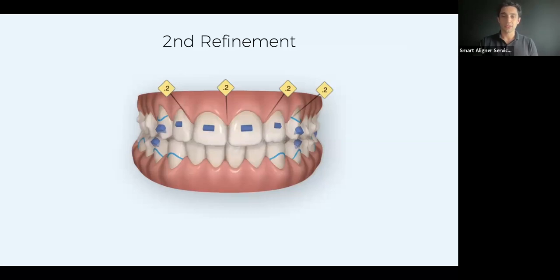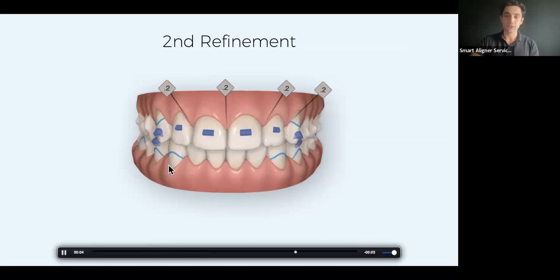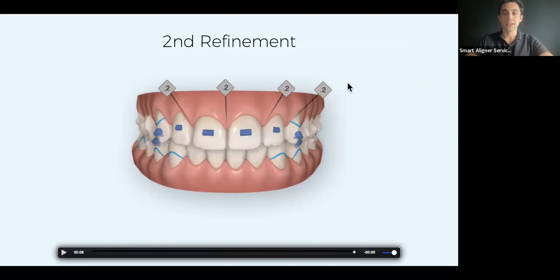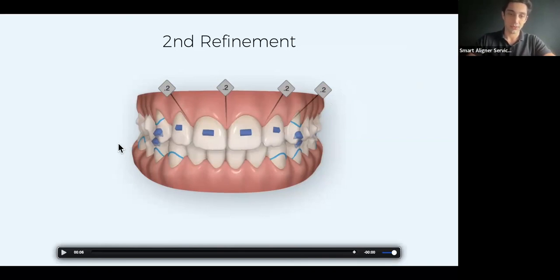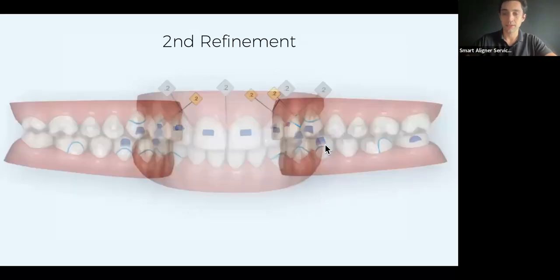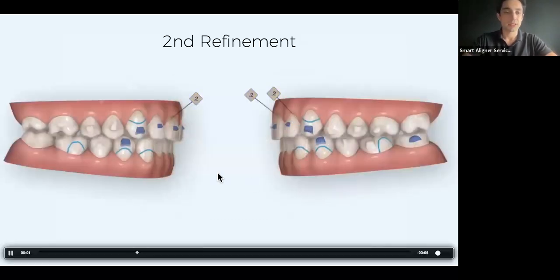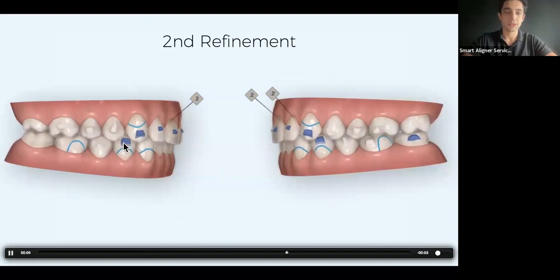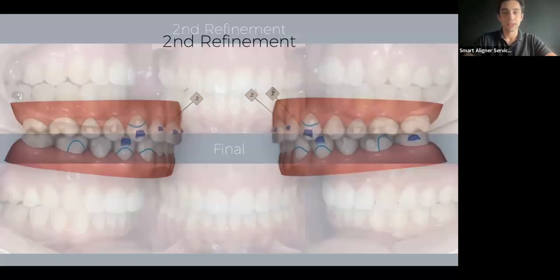Upper and lower midlines are not completely centered, so during the extrusion of upper teeth we place nighttime elastics from tooth 23 to 43 to ensure both midlines are centered. The midline discrepancy is solved with nighttime midline elastics combined with Class 2 elastics on the right side. On the left side we also placed a Class 2 button but didn't need to use it, as Class 1 was well maintained. After about 11 aligners of this phase, the result was achieved.